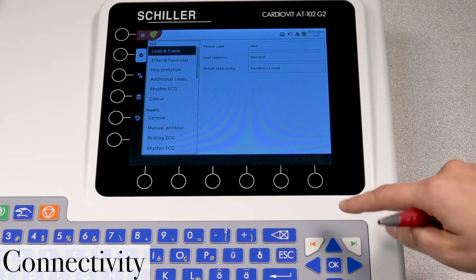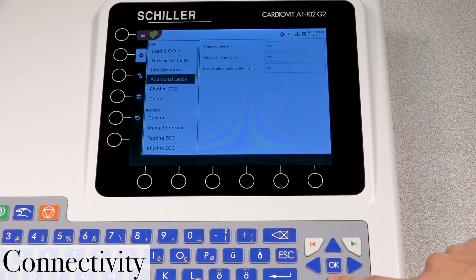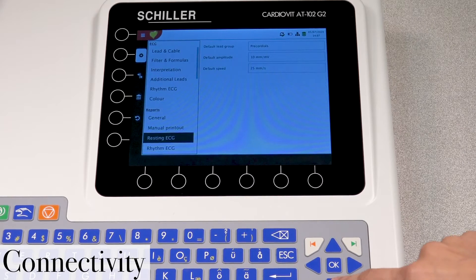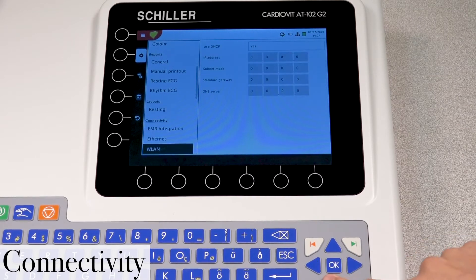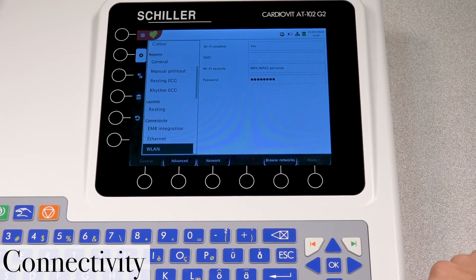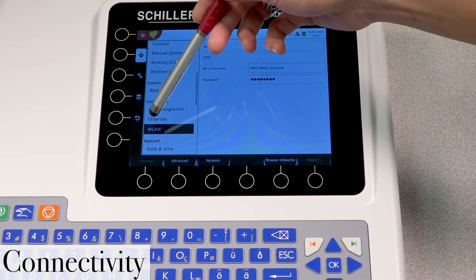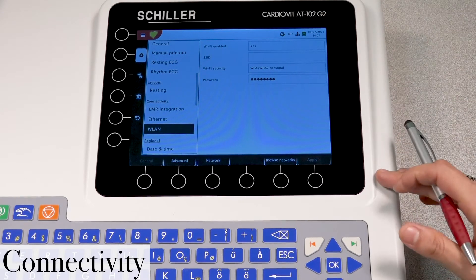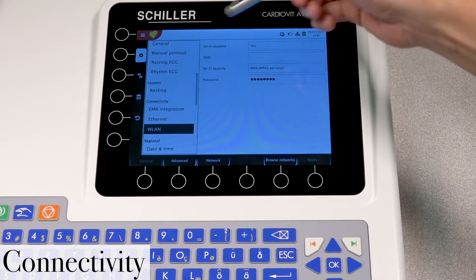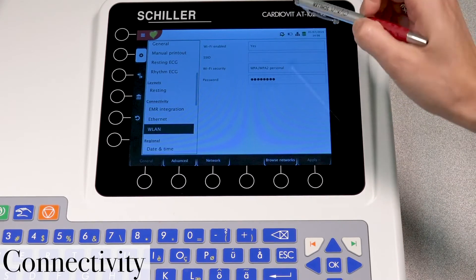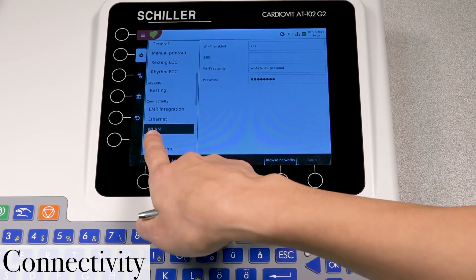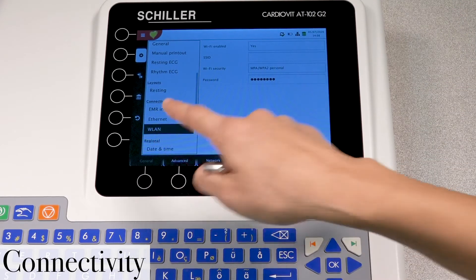And now we're going to use the up and down arrow keys here to navigate down to our designated area in which we are trying to look for the connectivity settings. So let's go into WLAN. Now here's where you'll set your Wi-Fi network. So in order to access this side on the right, what you first must do is have WLAN selected as seen here. Press OK.